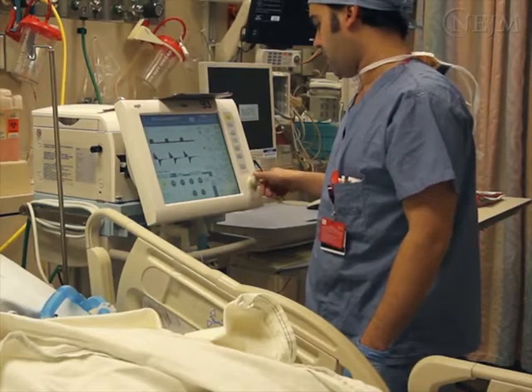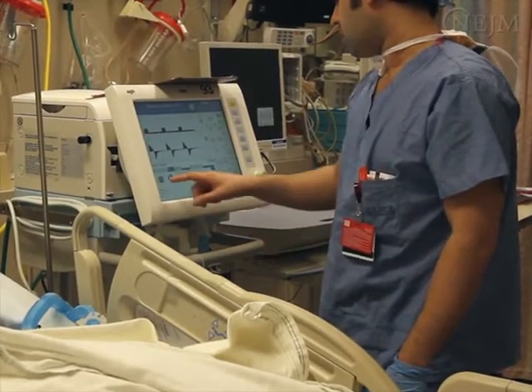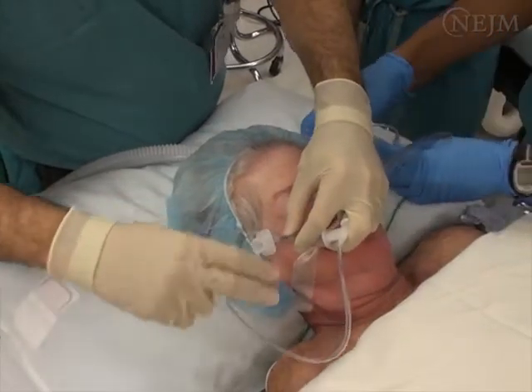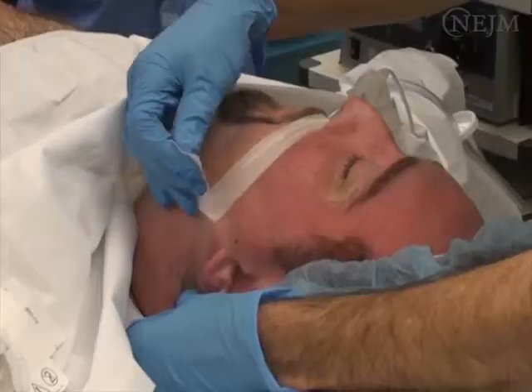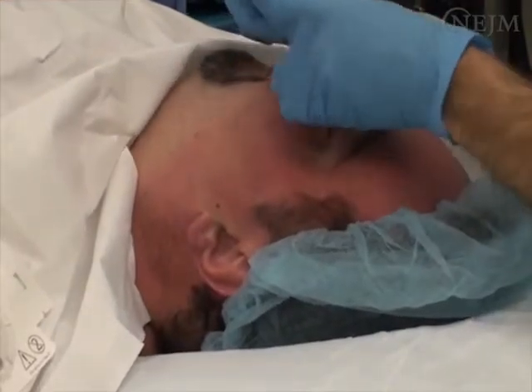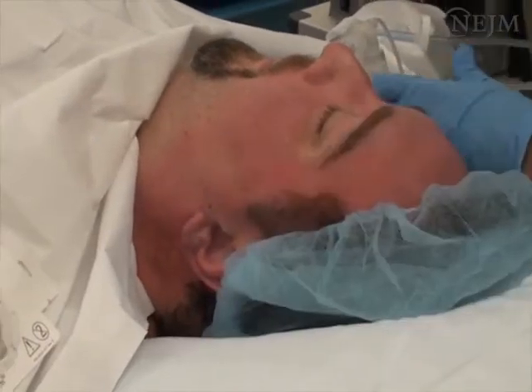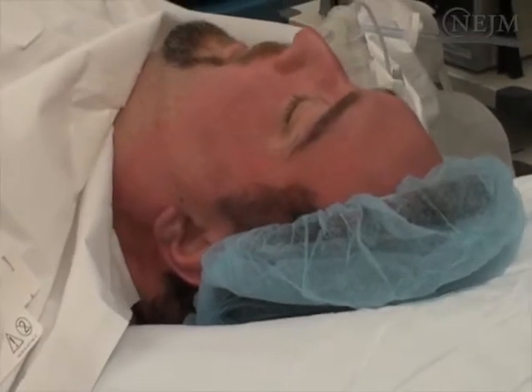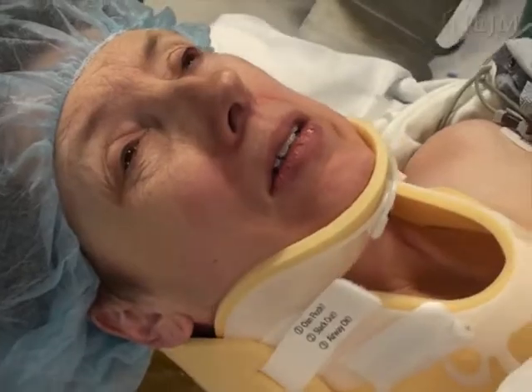Make sure that the tidal volume, respiratory rate, and inspiratory force are at appropriate levels before beginning extubation. Suction the patient's endotracheal tube using a disposable catheter or an inline suction device, and then carefully remove any tape or securing device in preparation for extubation. Avoid inducing abrupt head and neck movements, which may cause the endotracheal tube to stimulate the trachea and trigger coughing.